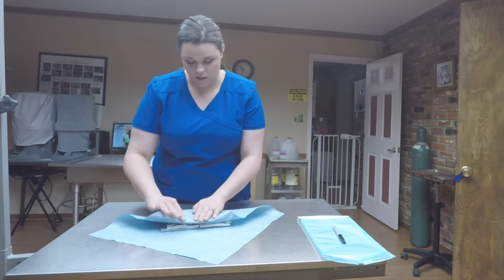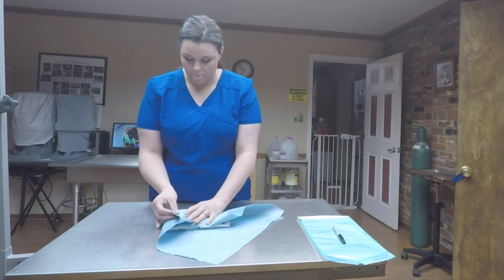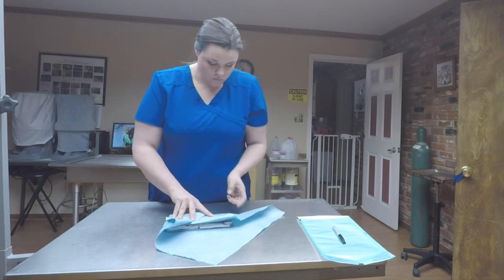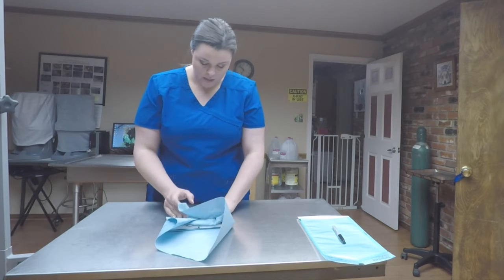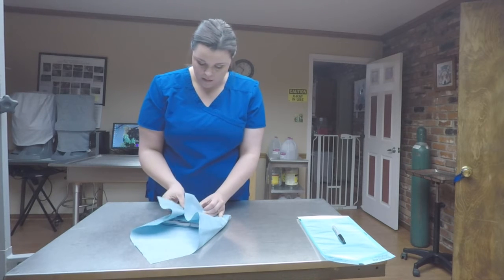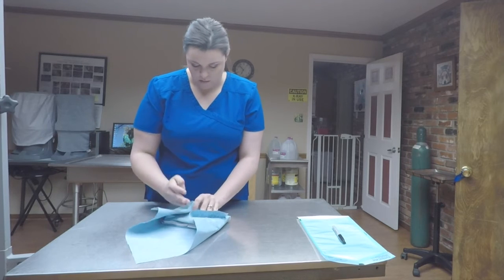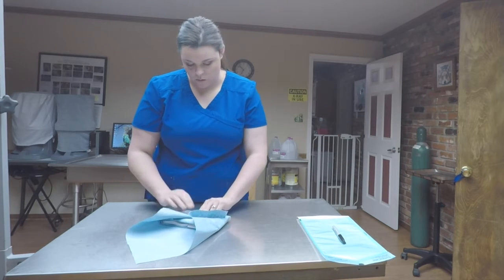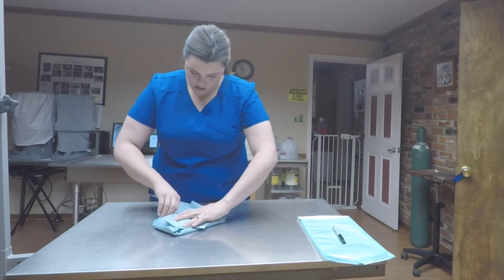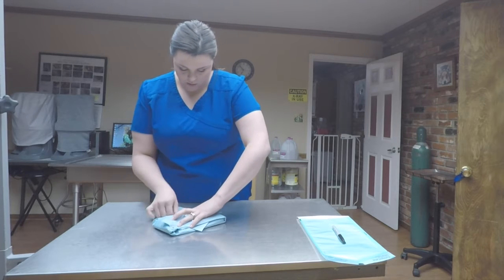You want to make sure that you leave the pull tabs on all sides. Then you'll fold this side in and leave that. This side in, doing the same thing. That way when they open it, it's easier to get into the back. And then, it's like an envelope style is what you're going for.